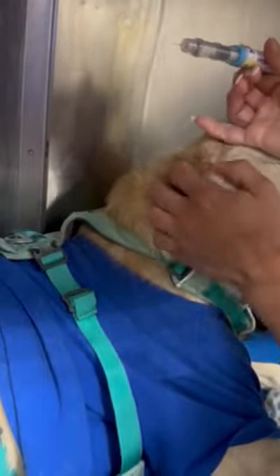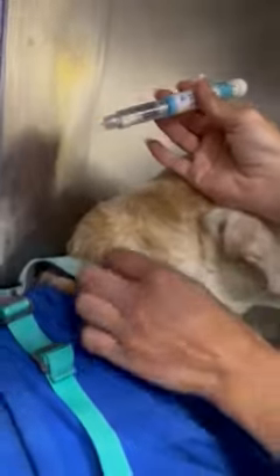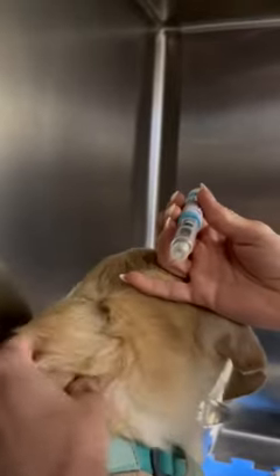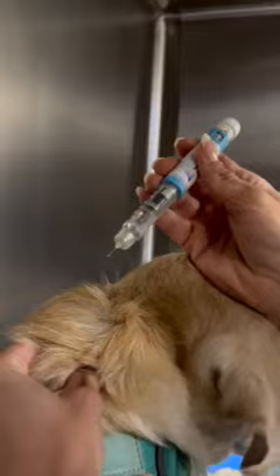This is our wonderful patient Stanley, and this is our pen that we've already gotten to the 23 units. Stanley has a little harness on — I'm just going to go right above his harness, kind of at the nape of his neck where his fat is, and we're going to go in parallel to the spine, not perpendicular.